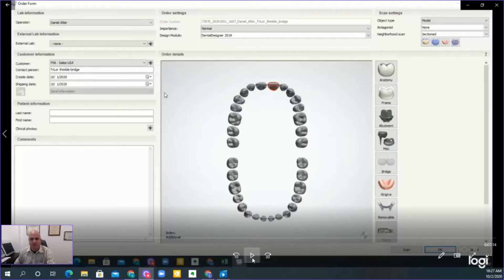Hello everyone, my name is Daniel Alter. I'm excited to be here with you to show and demonstrate a quick and easy way of doing a Thimble or Toronto style type of bridge with Trilor.